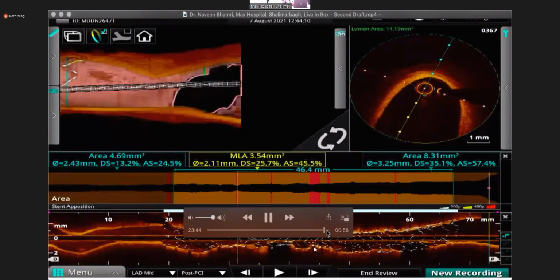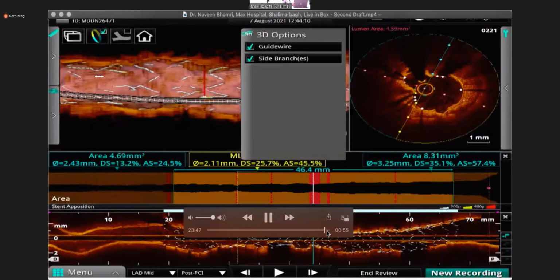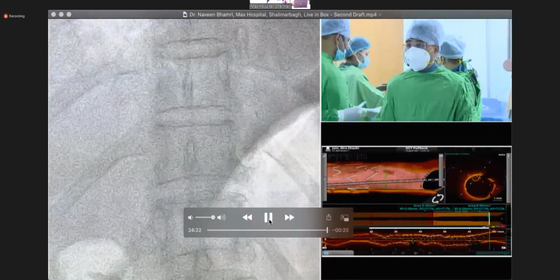I think, what do you say? Are you satisfied, Dr. Devender? Yeah, OCT image shows good. We are done with the 200 ml contrast. I think this is acceptable with the normal renal function.